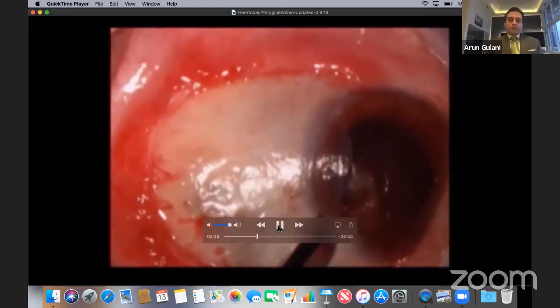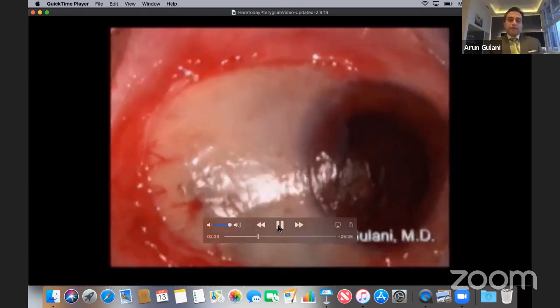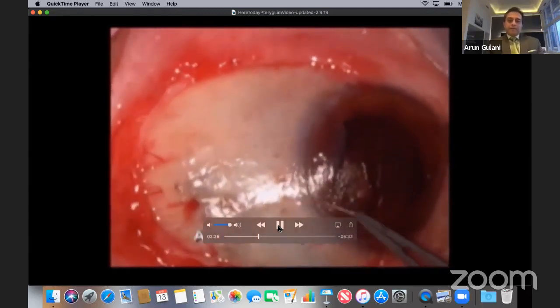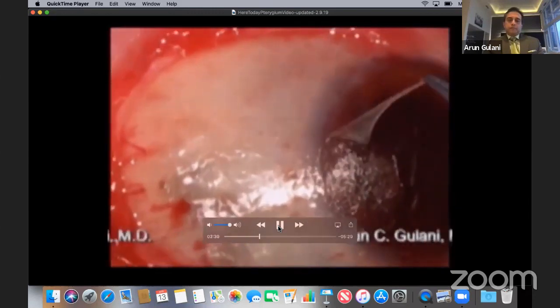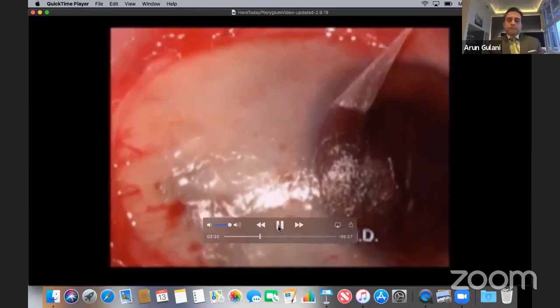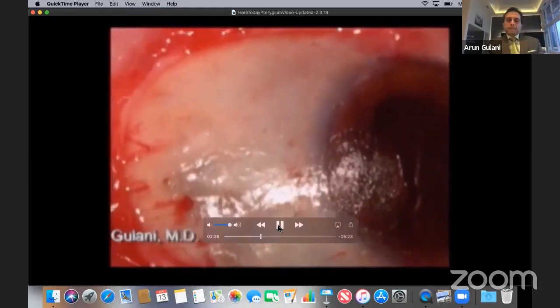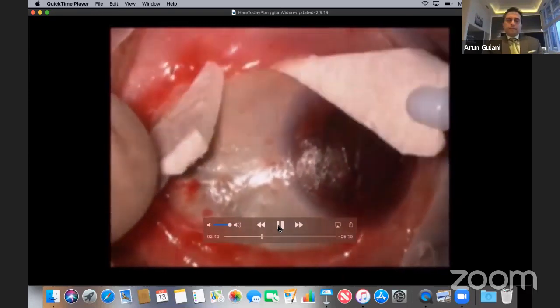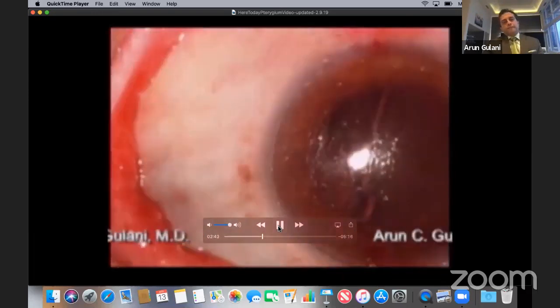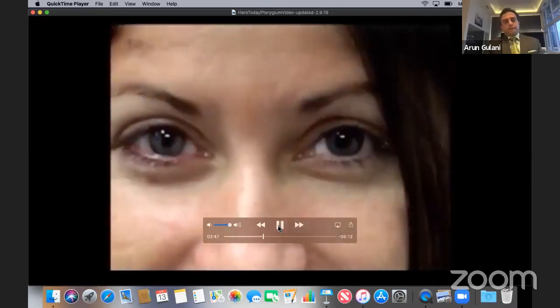No cutting on the cornea, as you can see here. You don't want to induce any astigmatism. Never cutting on the cornea. And peel away this excessive amniotic tissue to an elegant outcome so these patients can literally wear their contact lenses next day or get ready for refractive surgery soon. Excess glue is removed using Weck-Cells. An immediate post-op appearance. This is her left eye.